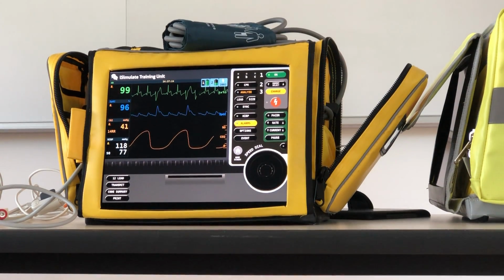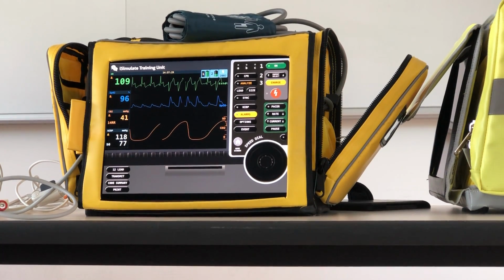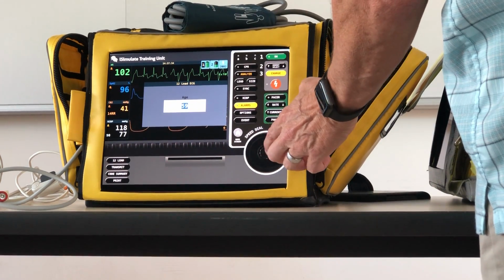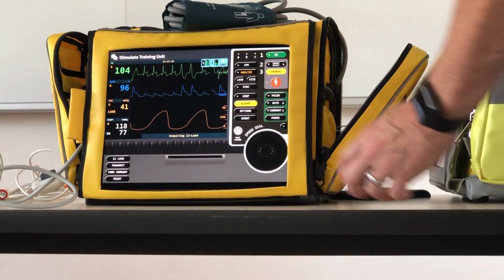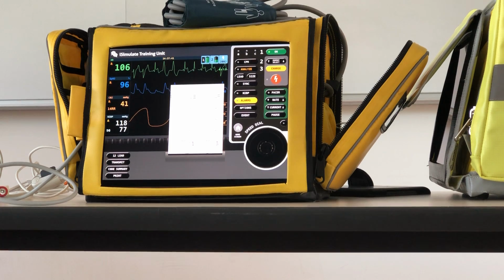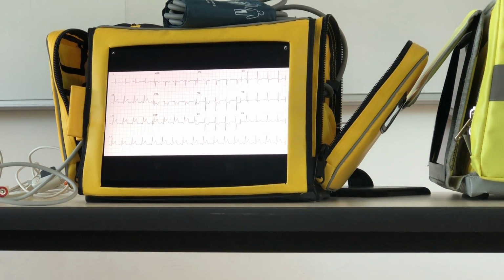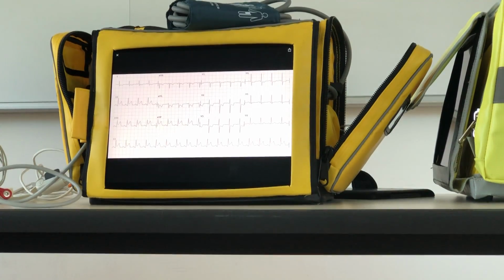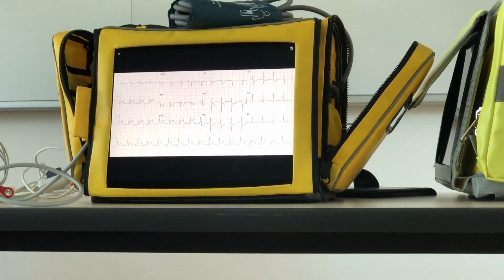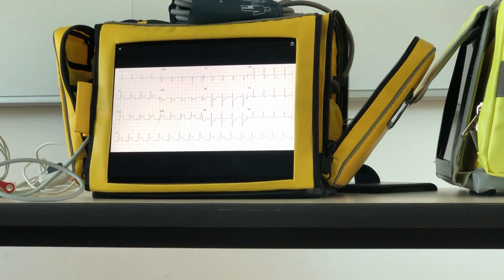I don't know. Let's find out. Okay, so we're going to send that. We got tons of ectopy. So we're on the LIFEPAK, so we have to capture it this way. Now we're asking the impossible: ectopy on 12 lead.